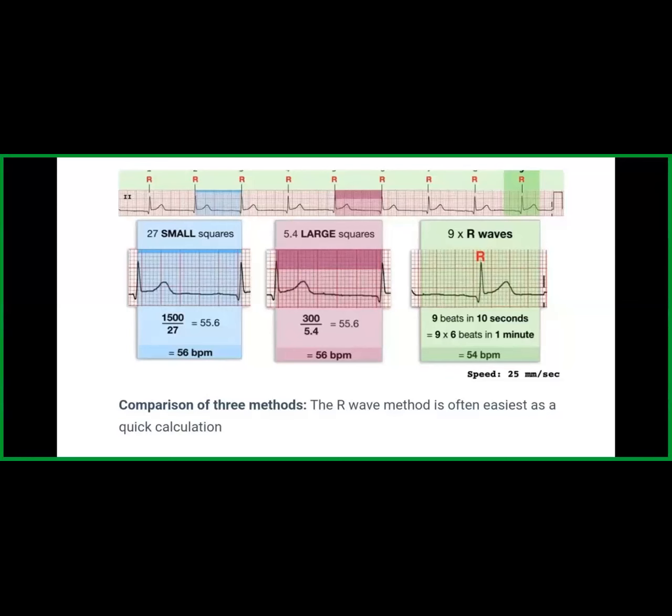You start CPR and you label it as pulseless electrical activity. And once you have given adrenaline, the same heart rate increases up to 102, and you decide to continue your resuscitation, and you do not give any more compressions. And with this as the modality to review this patient, the long lead 2 with the heart rate is the most important calculation which is needed.